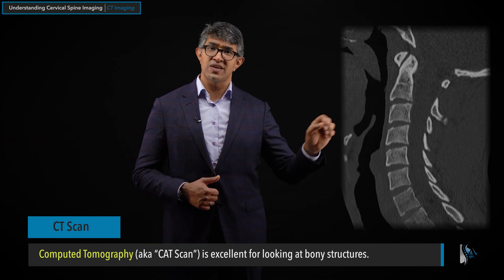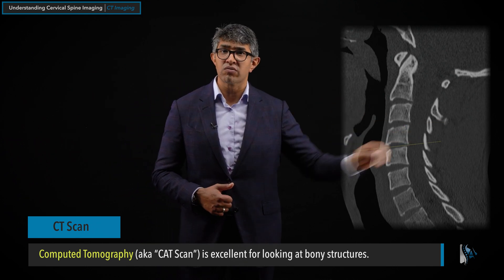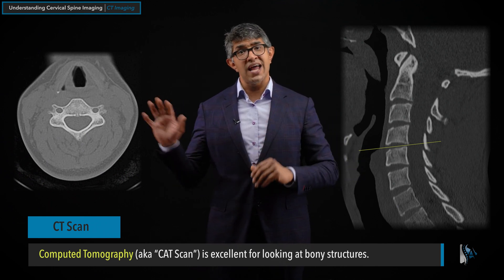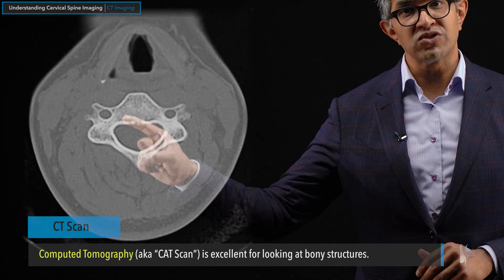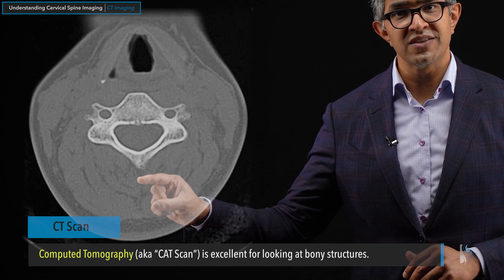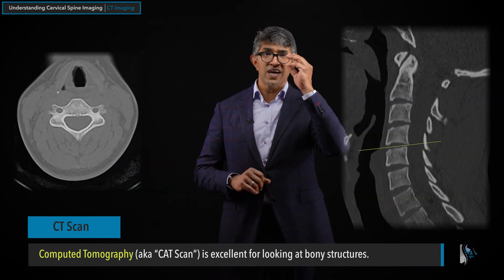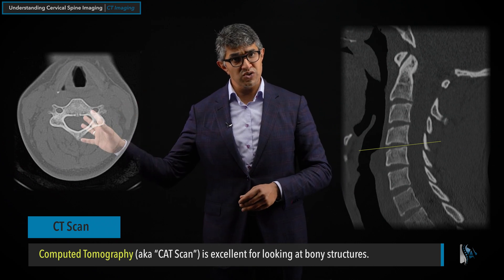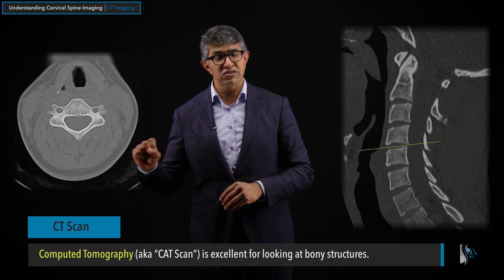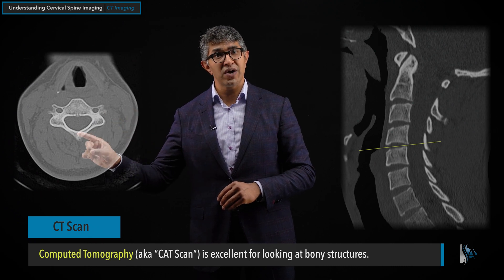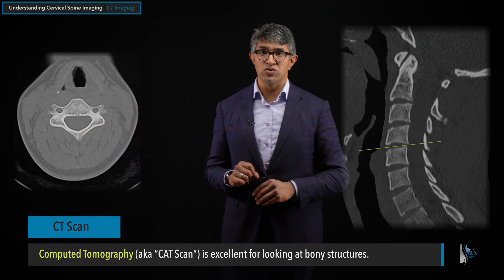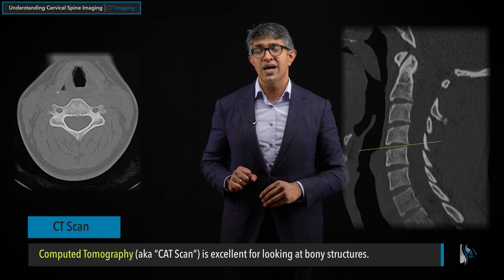So if you were to take this single slice and take a slice through it at C4-5, you would get an axial sequence image that looks like this. Here we're looking at the vertebral body in the front, the lateral masses, the lamina, and the spinous process. Those are all structures we talked about in the first chapter. Right here you can see the triangular-shaped spinal canal — that is where the spinal cord sits. You can't see the spinal cord itself, but you can really see very well what the spinal anatomy looks like.